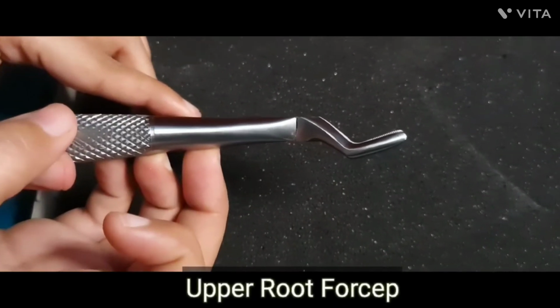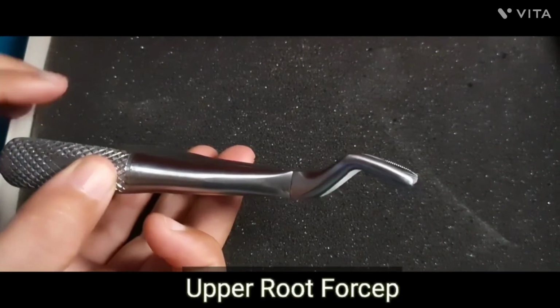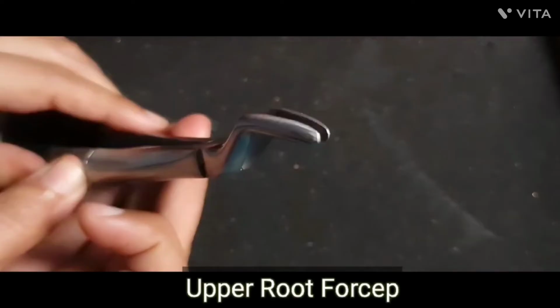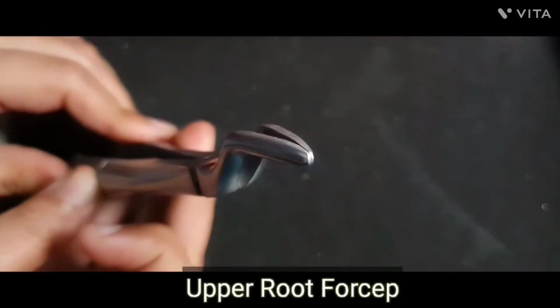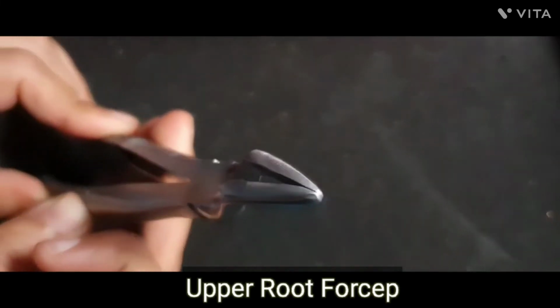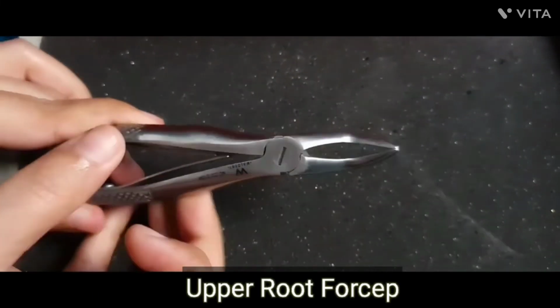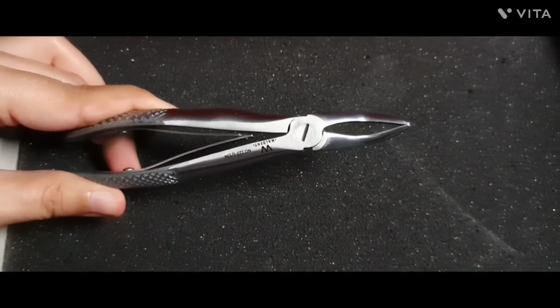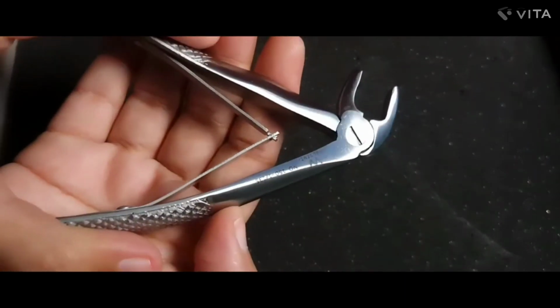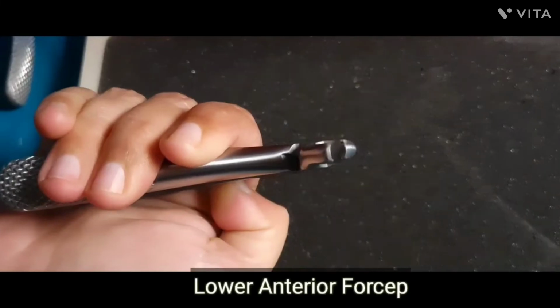The last forceps in the upper section is the upper root forceps. This is also known as bayonet forceps. If you close the bayonet forceps, you can see the beak closes completely, and that is how you can remove the upper roots. Since it is a straight forceps, it is upper, and the beak closes, that is why it is a root forceps.